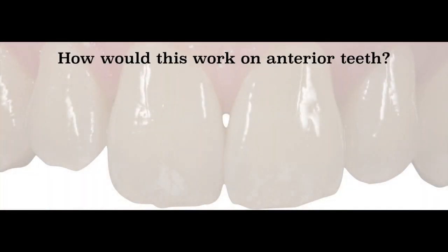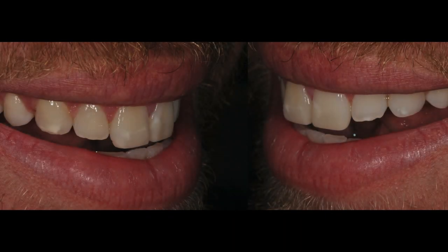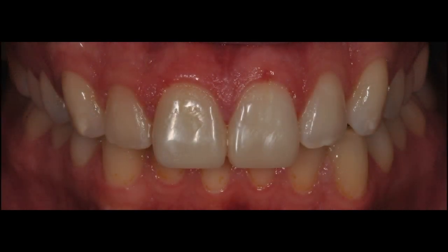So how would this work on anterior teeth? In this case, we plan to redo composite restorations on 8 and 9 due to fractures present on the lingual surface, and we plan to lengthen 6, 7, 10, and 11 so that all anterior teeth match in length. A retracted view just to show you the existing composites and the discrepancy in size with the laterals and canines.